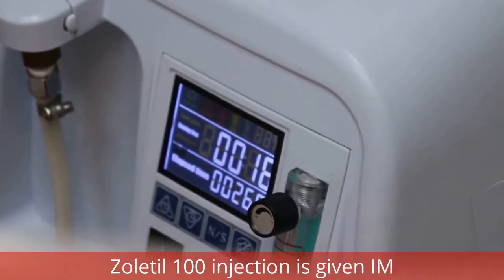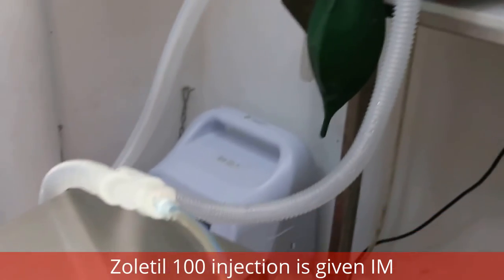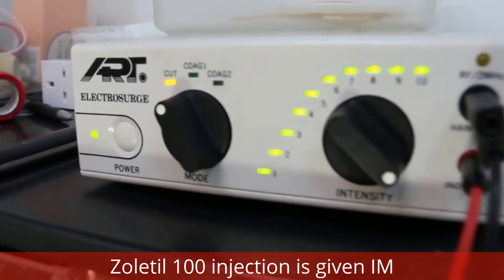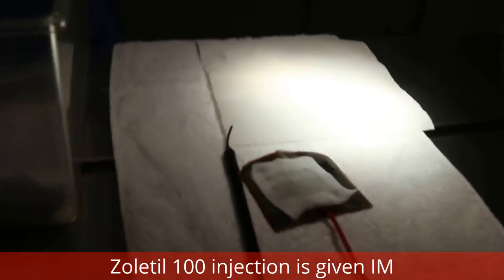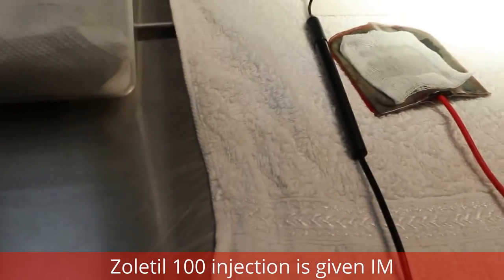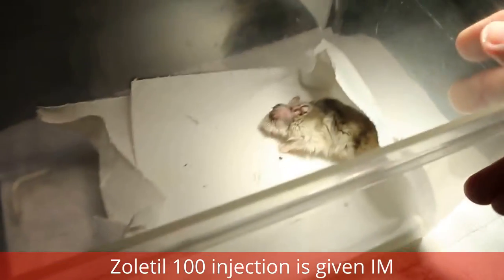That is the oxygen, what do you call that? Oxygen generator. So this is isoflurane, standby ready in case we need it. Normally we don't need it. This is the gas, and we already switched on the electrosurgery machine for the cut. The towel is here, but it's a bit small. Normally it should be bigger because the hand might touch the metallic part. Now you can see the hamster is going to sleep. He's down already. So get a bigger towel, and once he's down, after about 5 minutes I will start.